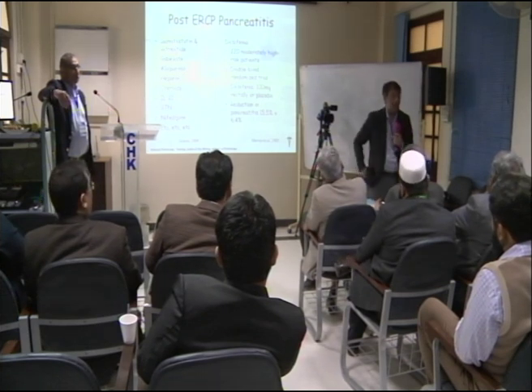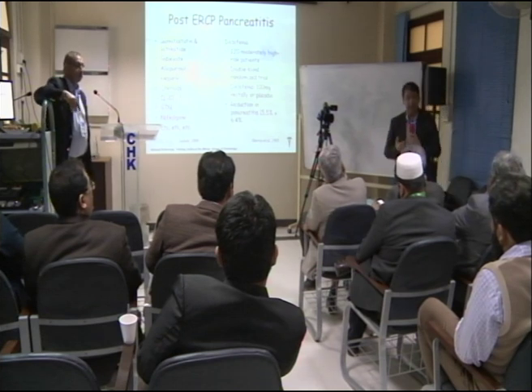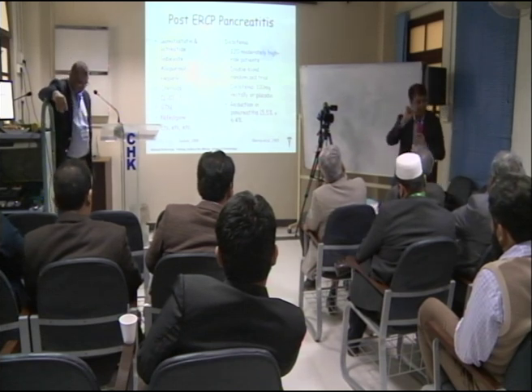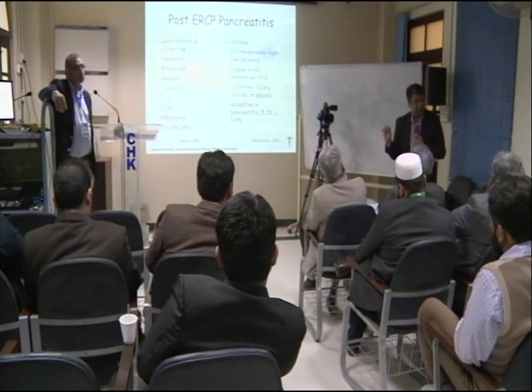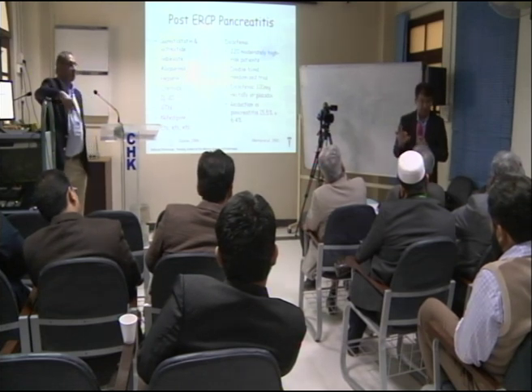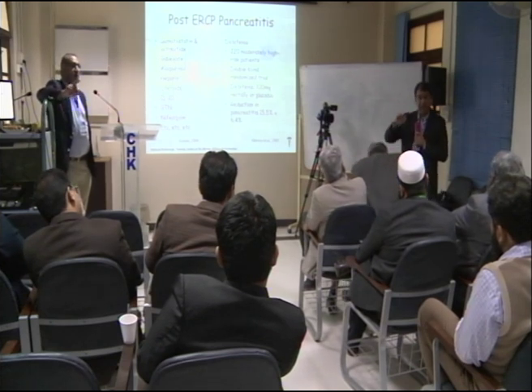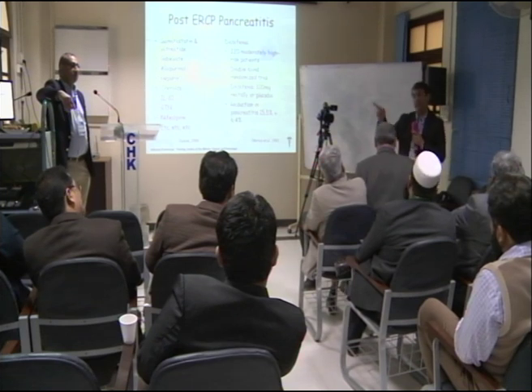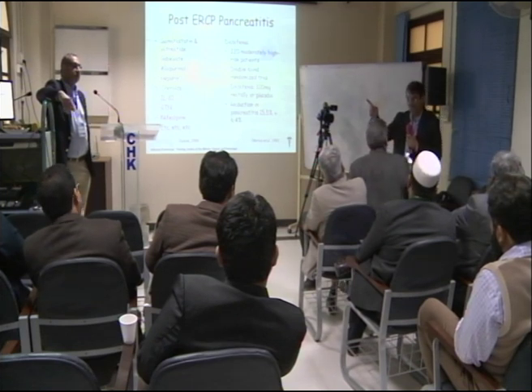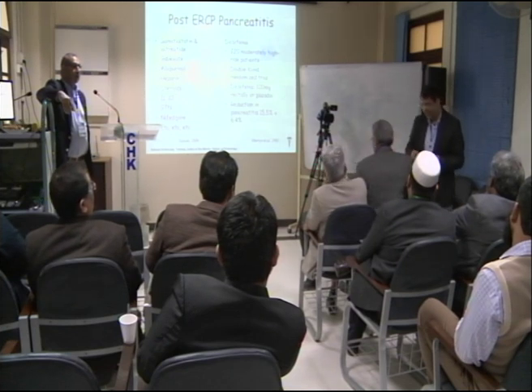We have every type of wire, we have every type of stent. So I will choose the best, smallest, longest stent, and without any internal flanges. If possible, pigtail stent. That's what I use for post-ERCP pancreatitis because I don't want to put a straight stent which has the internal flanges and then the stent migrates into the pancreas. I couldn't emphasize the last bit more. I only use single pigtail stents.